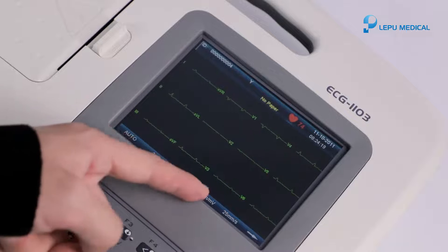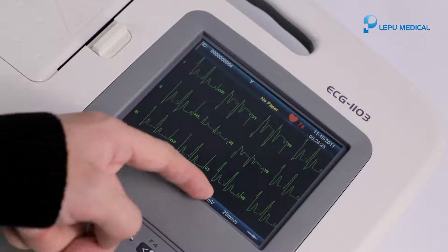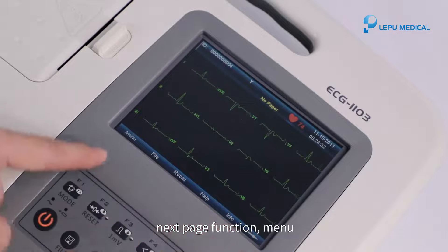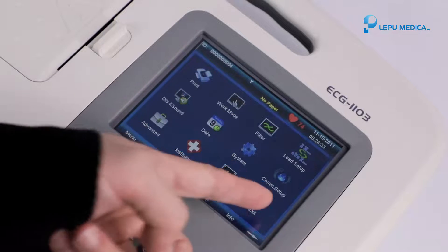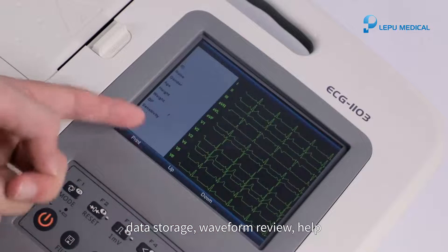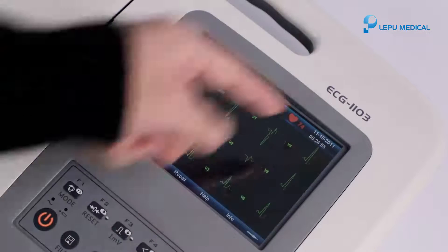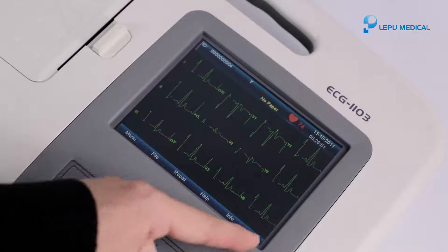Switch sensitivity. Switch paper speed. Next page function. Menu. Data storage. Waveform review. Help. Create or edit patient information. Next page function.